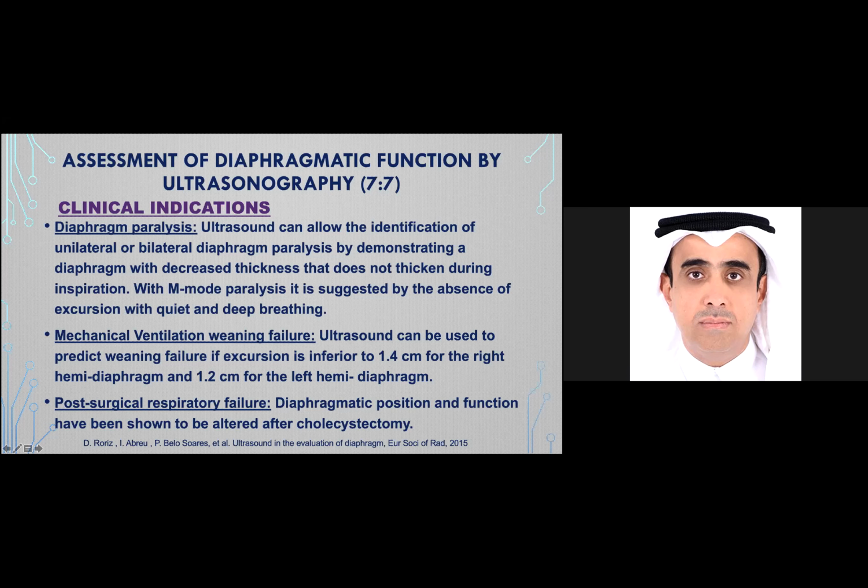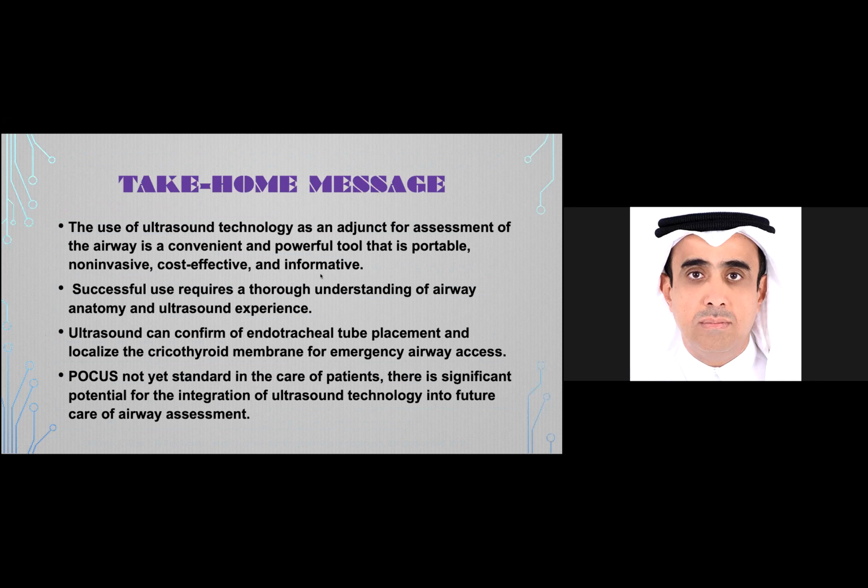You have to use ultrasound technology as an adjunct assessment for the airway. It is convenient, portable, non-invasive, cost-effective and very informative. It is very helpful at the level of medical school to become familiar with the anatomy, and you can see this is a static and dynamic anatomy of the airway.